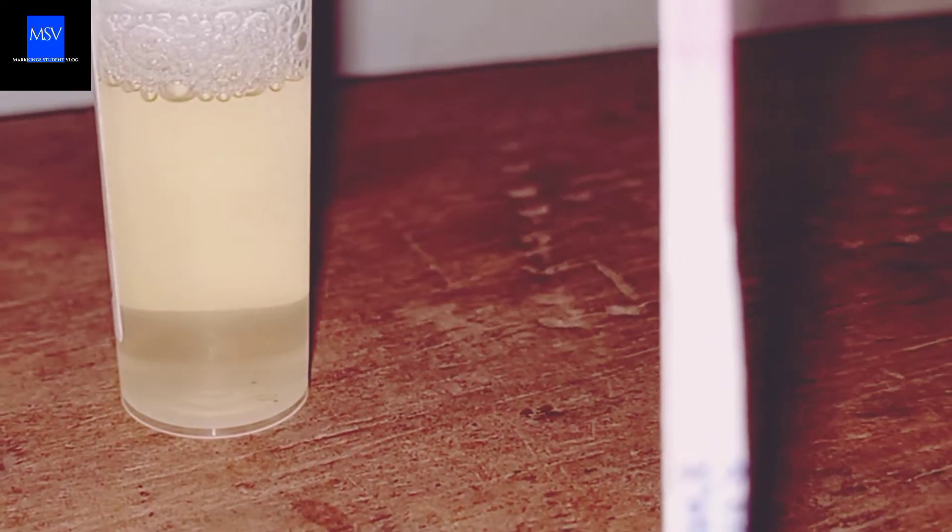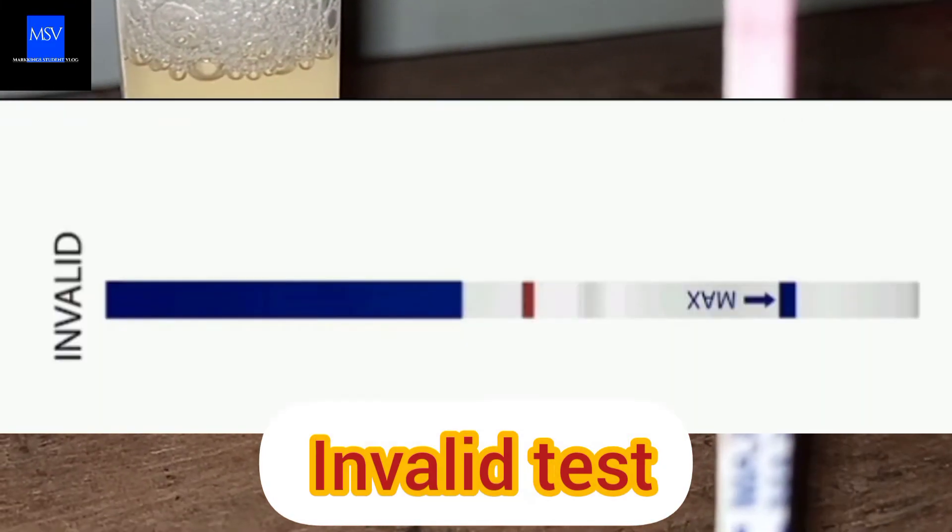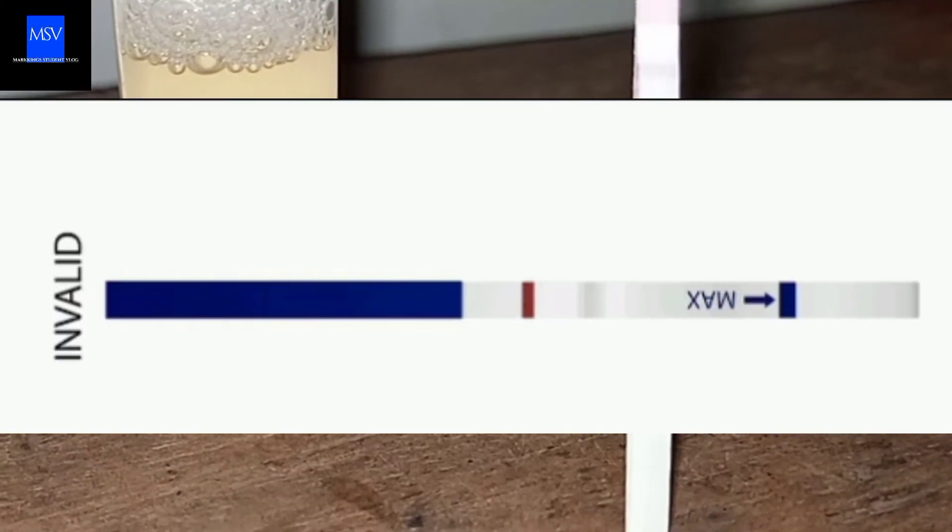Furthermore, the test can also be said to be invalid if a red line appears below on the test reading area. And that's all for the urine test.